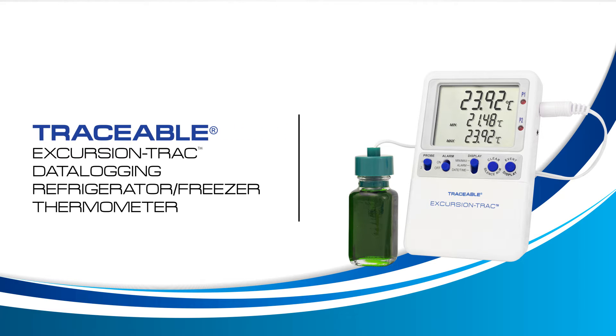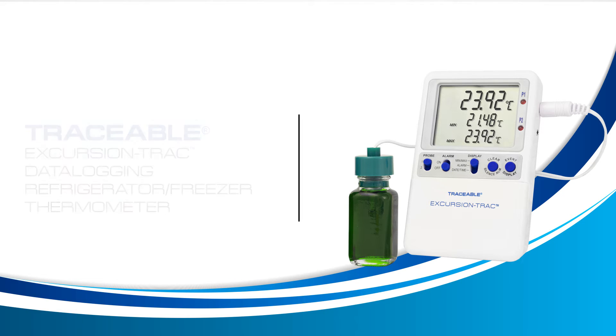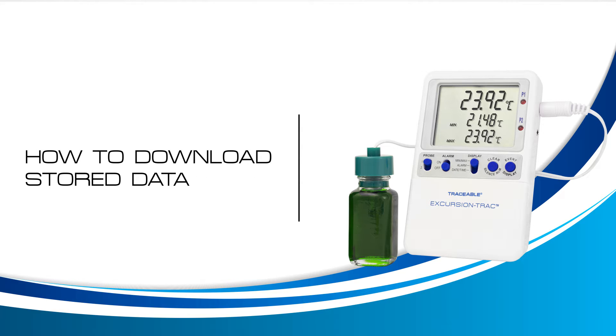Welcome to a Traceable Products instructional video for the Traceable Excursion Track Thermometer. In this video we will learn how to download your stored data. Let's get started.